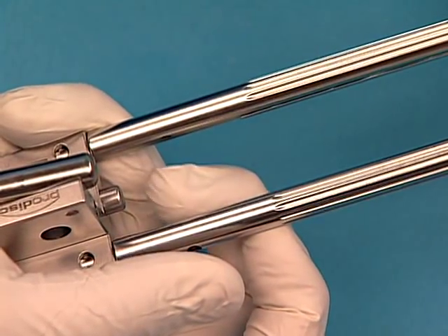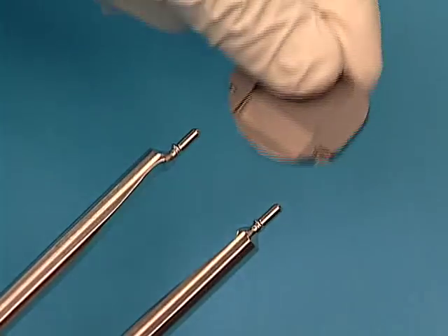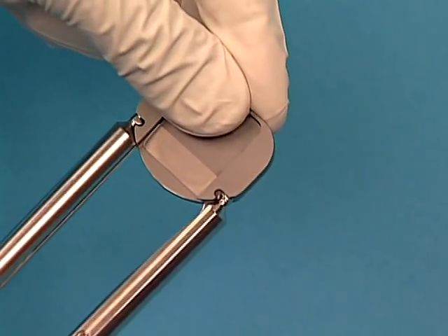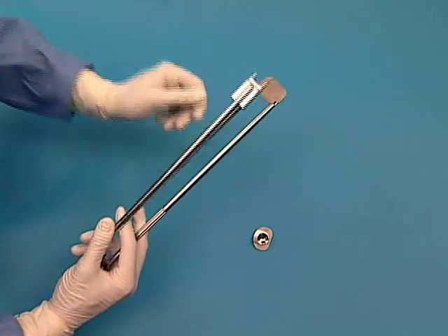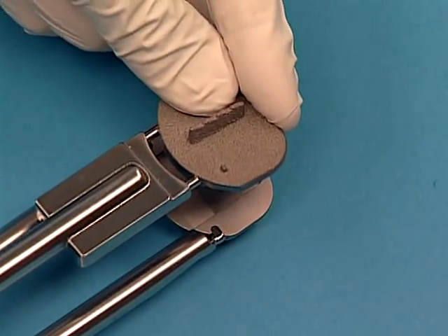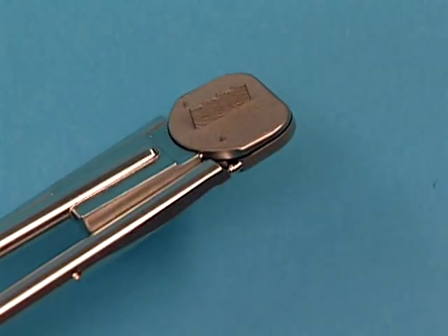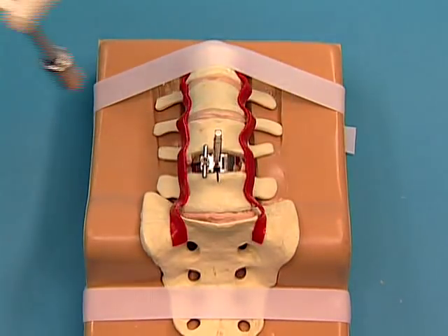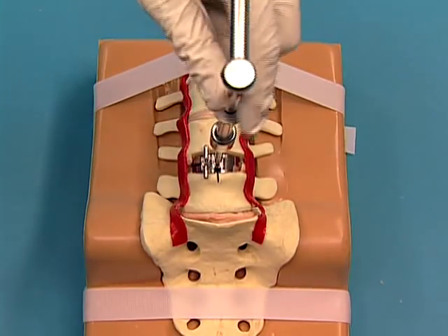Press the release button on the back of the inserter and rotate the inferior arms outward. Assemble the inferior end plate onto the pins of the inferior arms. Press the release button and rotate the arms inward to lock the inferior end plate onto the pins. Load the superior end plate onto the pins on the superior arms of the inserter. Nest and hold the two end plates together by firmly gripping the inserter arms. Remove the chisel with the slotted mallet. Attach the trial handle and remove the trial. Ensure the disk space is clear of any disk or bony debris.